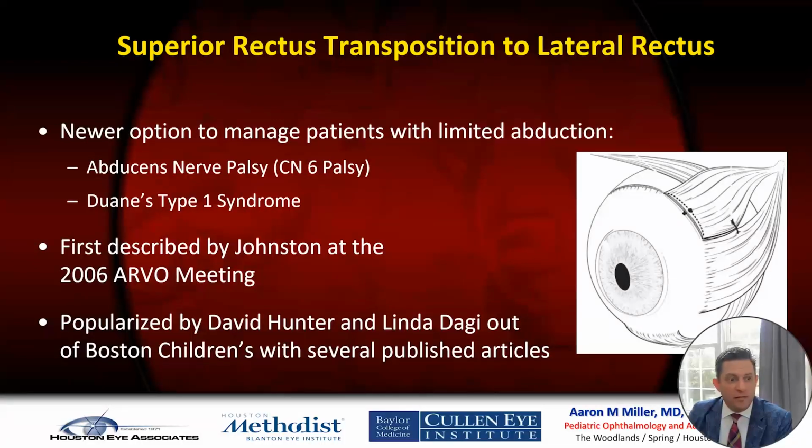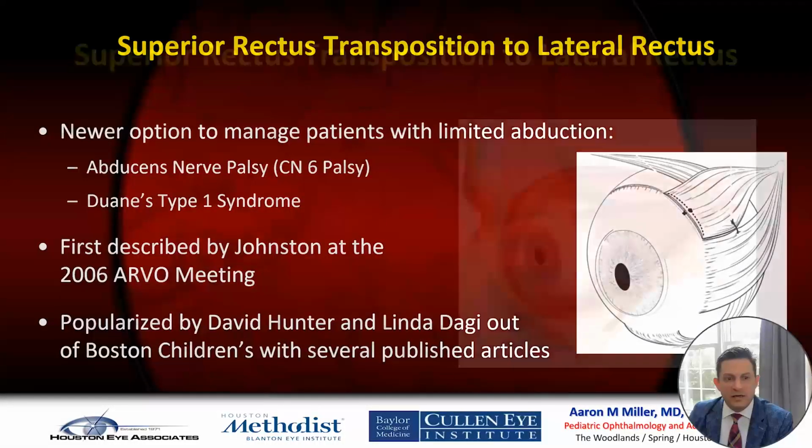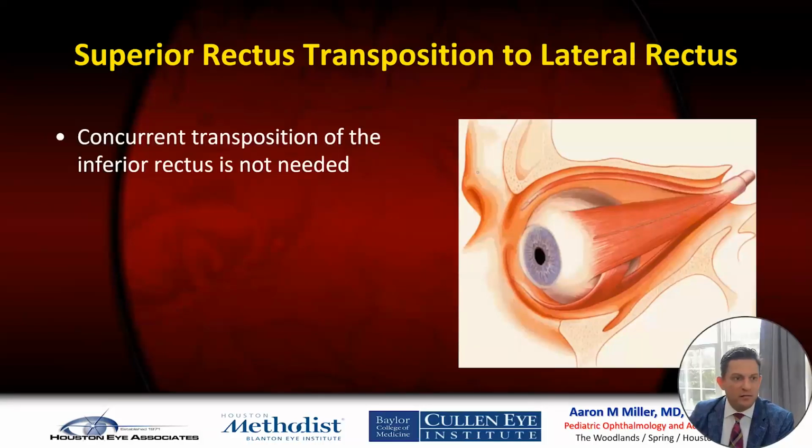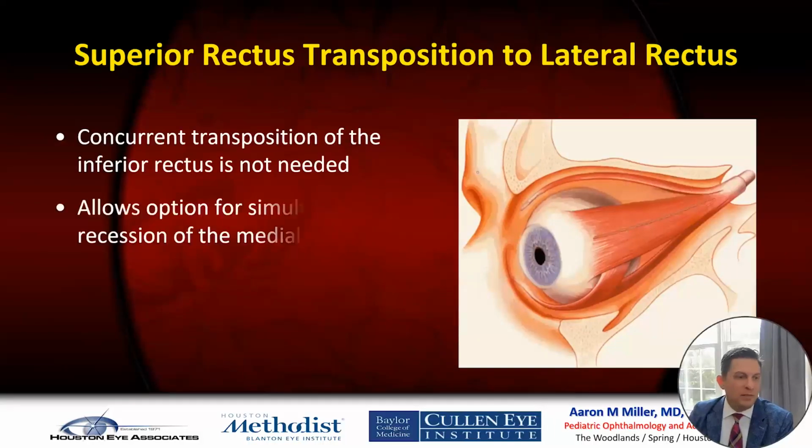But after being a bit of a doubter, I've taken this on and use it a fair amount when appropriate for certain select patients, most often adult strabismus. I found that this procedure with augmentation with posterior fixation, as seen in this photo, is one technique. I've also done it without fixation, which is shown in this picture here.